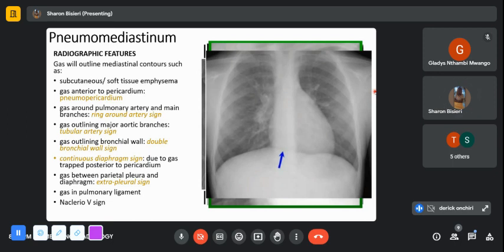I know there have been many images posted about recurrent esophageal dilatation. For me, I don't know if it's really strictures, but there are usually also patients who present with achalasia cardia. But my question to the class was, how frequently should we be doing esophagograms as opposed to endoscopies? Or maybe how practical is the situation in terms of detecting esophageal tears?